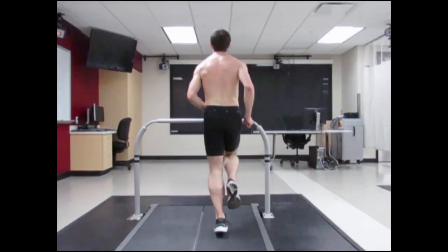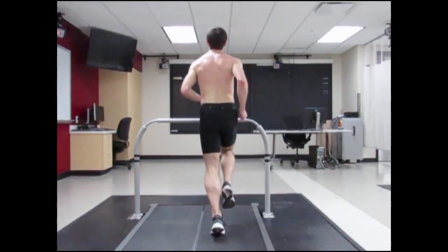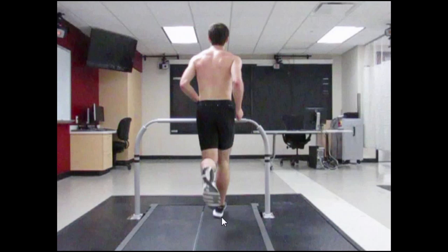To assess frontal plane joint kinematics, again, our camera needs to be aligned perpendicular to the frontal plane, and we'll be using a high-speed recording so we can see the amount and extent of motion that is occurring. I'm going to freeze the image or slow it down to the point of right foot initial contact. He's displaying a rear foot strike pattern, which is difficult to see from this view, so best appreciated from the sagittal view. But nonetheless, we can see the initial contact occurring on that posterior lateral corner of his right foot.